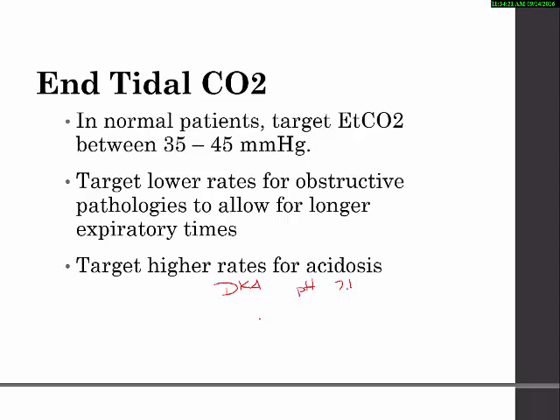So maybe you're going to see the vent settings set so that you have an EtCO2 of, let's say, 34. All right, and that's where they need it to be. So this could be an EtCO2 of 34 millimeters of mercury, and that is what the vent settings are going to look for. We'll know that when we get there, and they'll tell us to check that out.